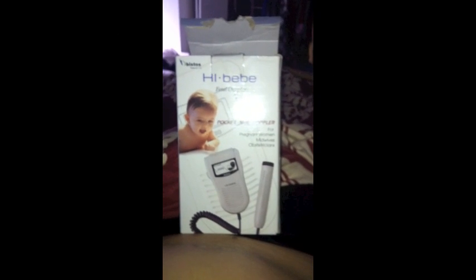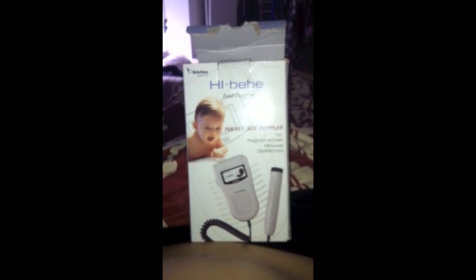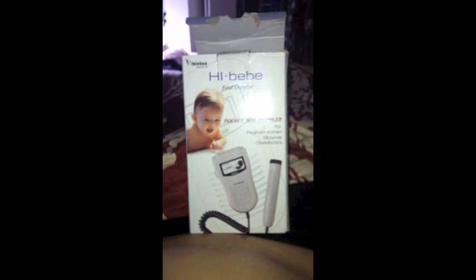Hi ladies, this is Andrea, aka Dr. Gums, and today I'm going to make this tutorial to show you how I find my baby's heartbeat.